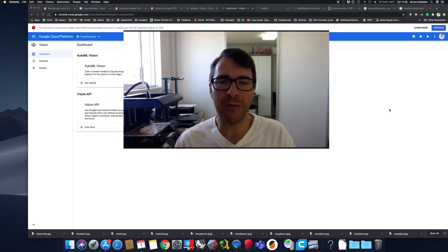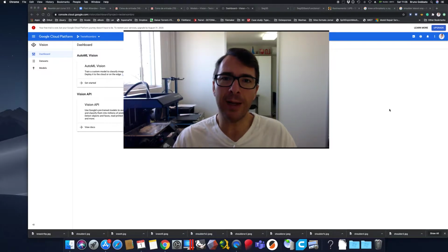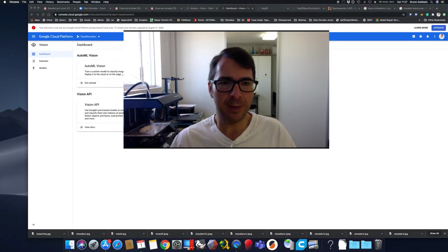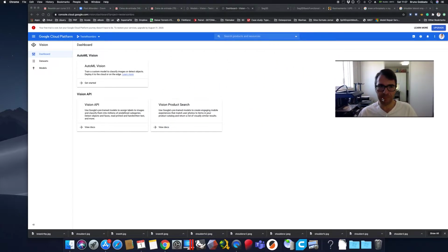I'm speaking directly from Brazil, and in this video we are going to show you how to create your own machine learning robot to help give X-ray diagnostics based on image vision, image classification, AI, artificial intelligence. We're going to use the Google Cloud platform that is open for everyone, and we're going to show how we can do it.